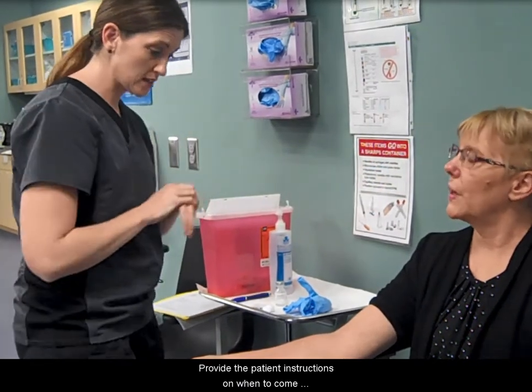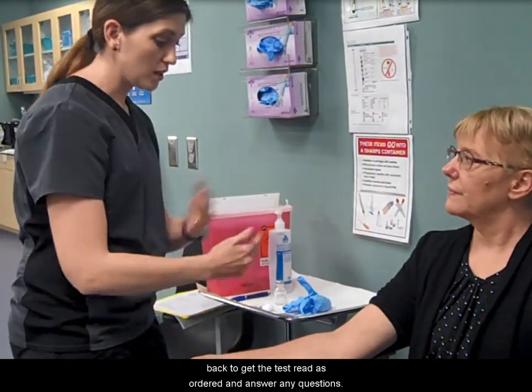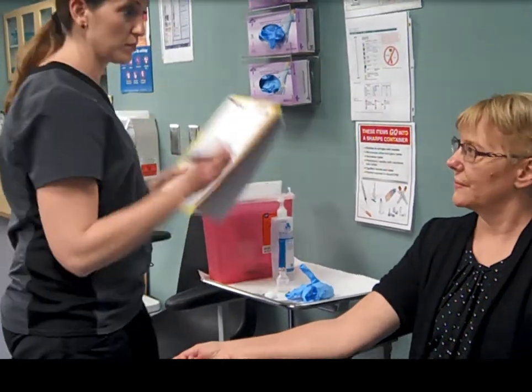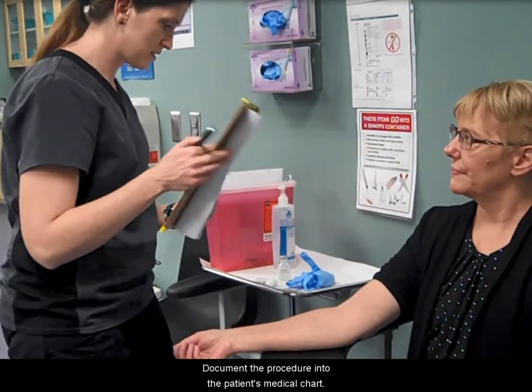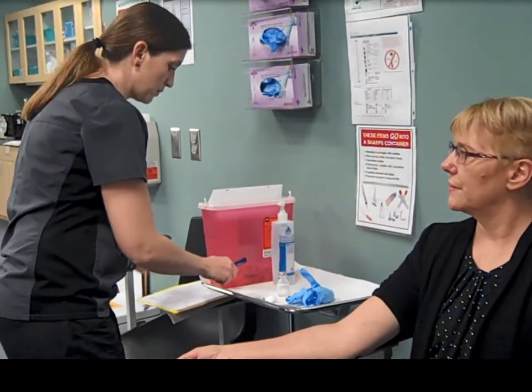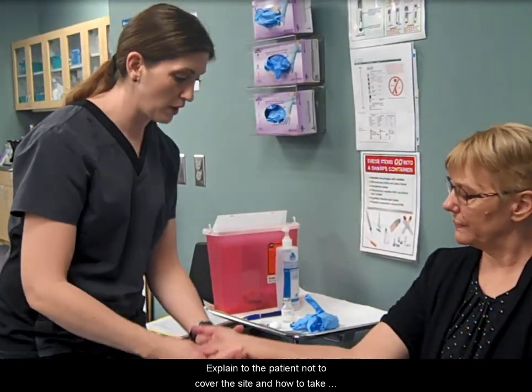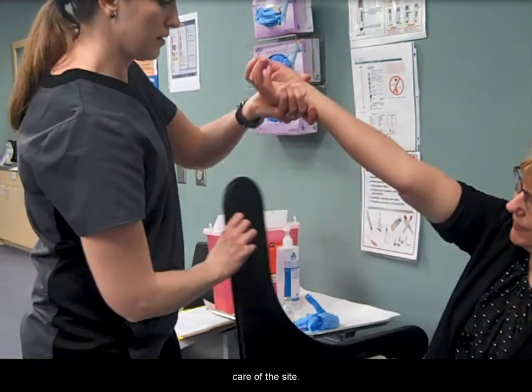Provide the patient instructions on when to come back to get the test read as ordered, and answer any questions. Document the procedure into the patient's medical chart. Explain to the patient not to cover the site and how to take care of the site.